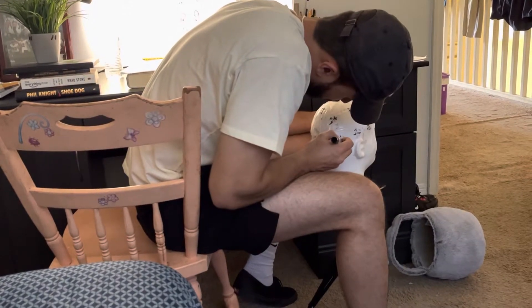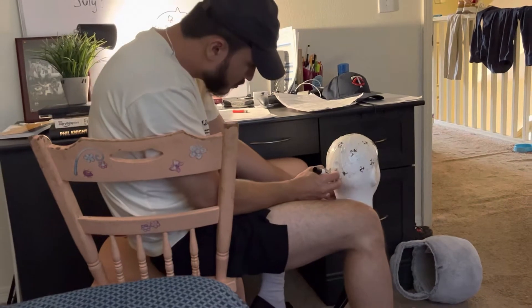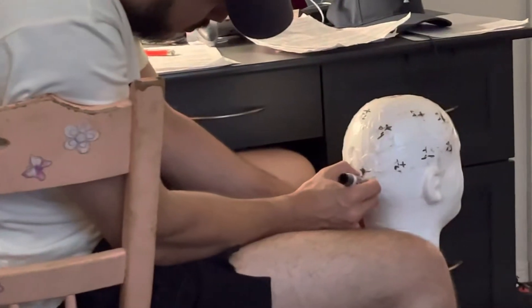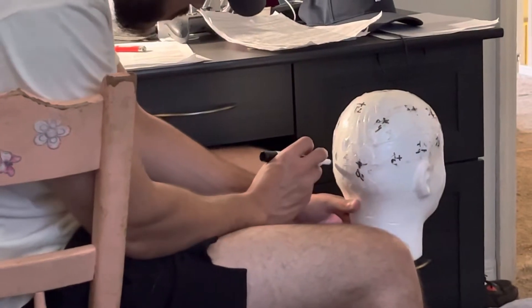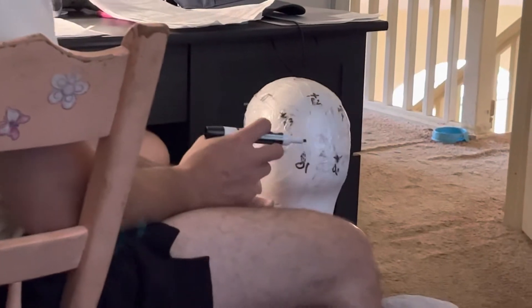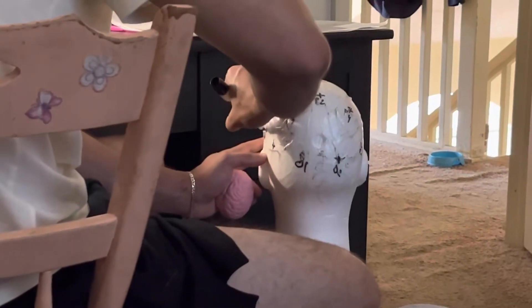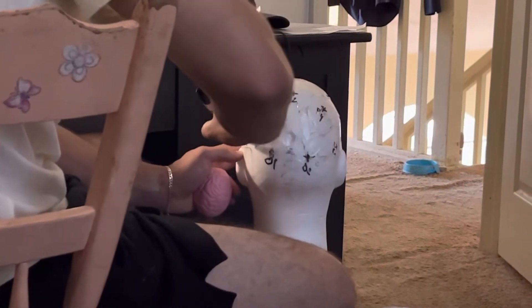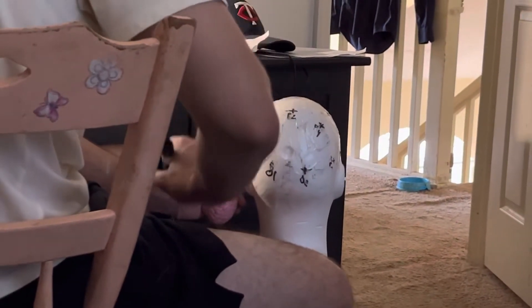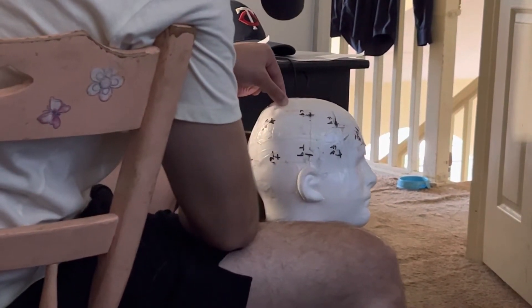There's some tape on the mannequin head so it easily washes away. So here he is going — we're going to check his answers after he's done, and I think he's on a roll. So he just marked O2, now he's marking O1 — hopefully correctly. Okay, he got it. And now let's see if he can get the left side of the circumference correct, or as I like to call it, the headband. So he should be marking T3 and T5, but it's a little hard to see, so we'll check his answers in a bit once he's finished.